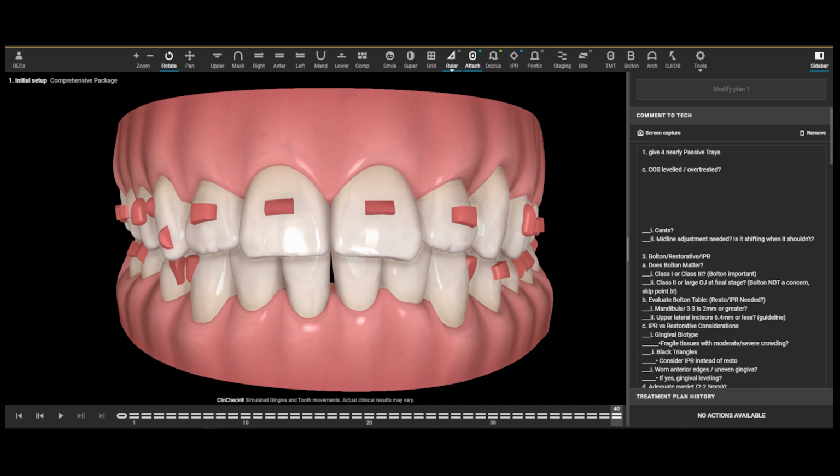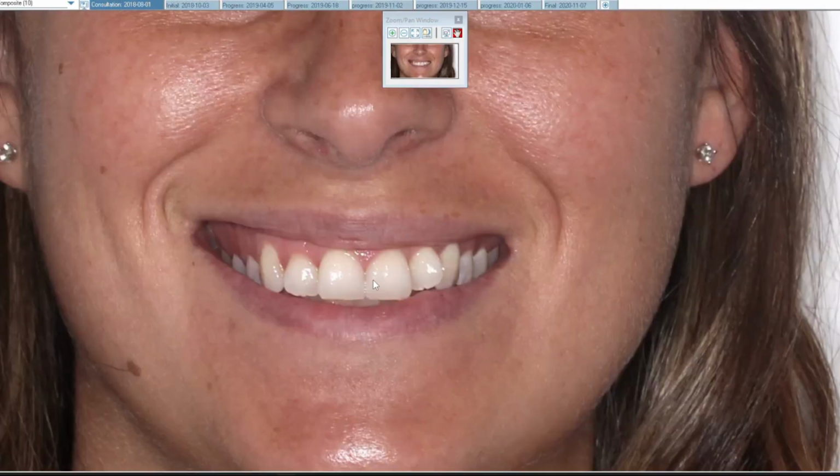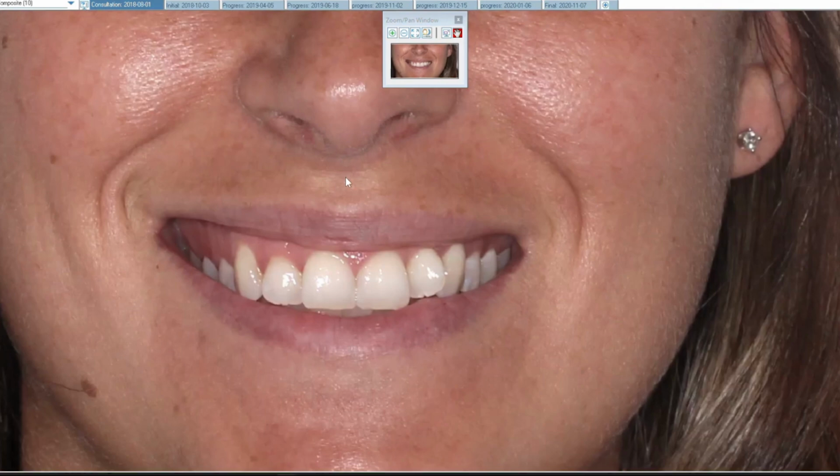So let's go back to the patient's smile. Now, everybody's going to have some facial asymmetry. It does look like her midline is deviated more to her left. So if we look at the middle of her nose down to her philtrum right here, and then we look at the middle of the teeth, her dental midline is to the patient's left, ever so slightly. Now, midlines can be shifted up to 4 millimeters without a layperson being able to recognize that. But it is something that we can make some improvements on.